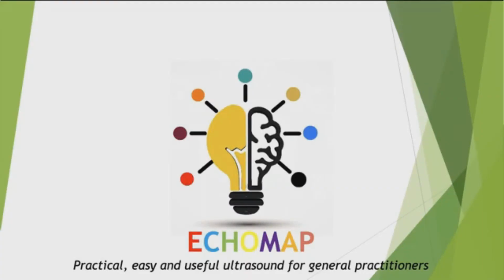Welcome to ECHOMAP, the practical, easy, and above all useful ultrasound tool for general practitioners. So today we're going to look at a musculoskeletal clinical case. Really not obvious. And you'll see, it's not for the reason we think. And I'll show you that in musculoskeletal, you also need to know how to think a little outside the box.